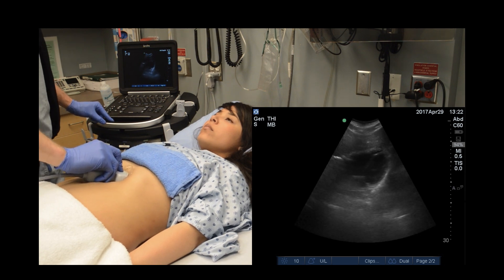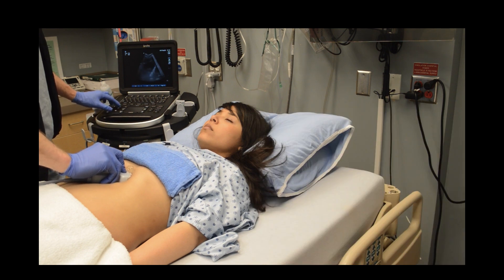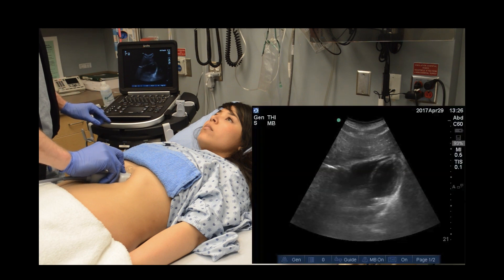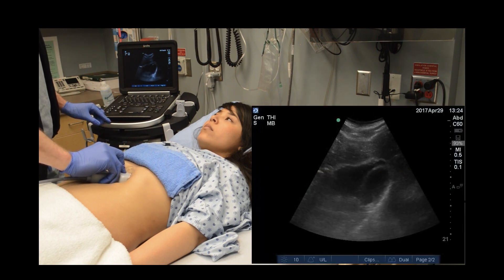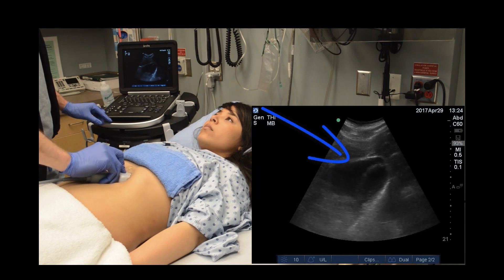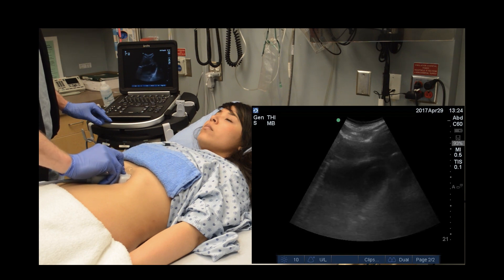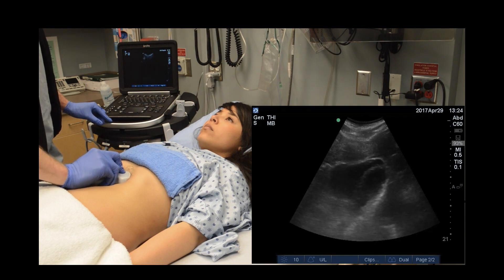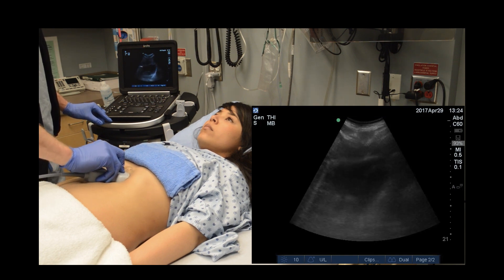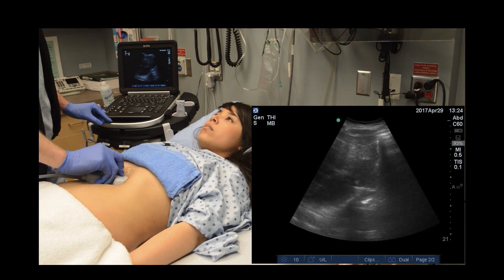I am pushing hard enough to allow the skin to envelop the probe, creating good contact. Once the heart is identified — usually as the thing that is moving on the screen — I make sure it is centered and adjust the depth. The area of interest is the inferior pericardium. If you are having trouble finding the heart, you will likely need to be more anterior, and this can be accomplished by flattening the probe on the abdomen. If this doesn't work, slide the probe to the patient's right to use more of the liver as an acoustic window. You will have to center the heart by heeling the probe to the left.